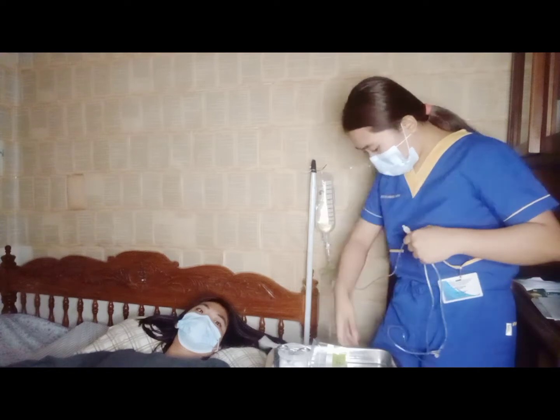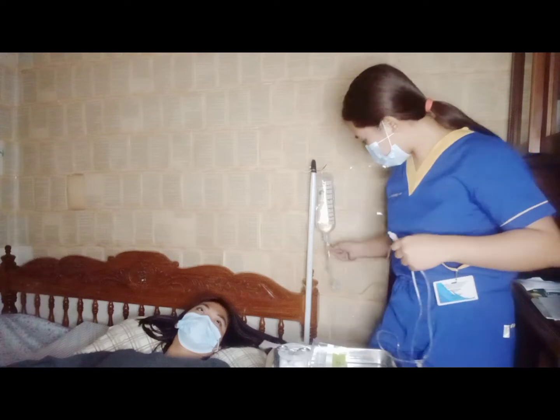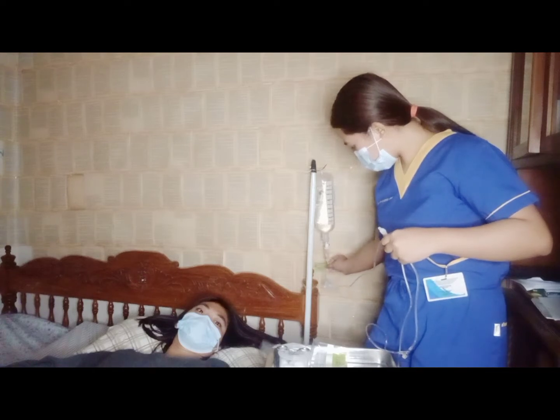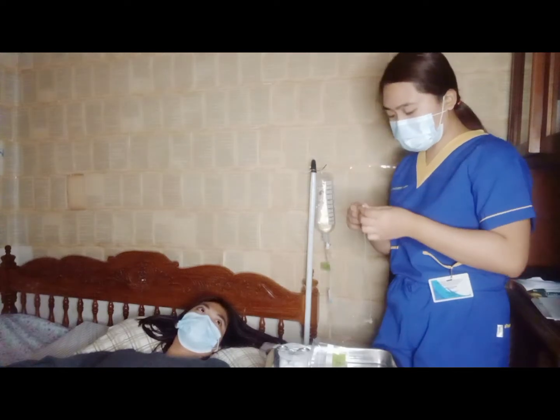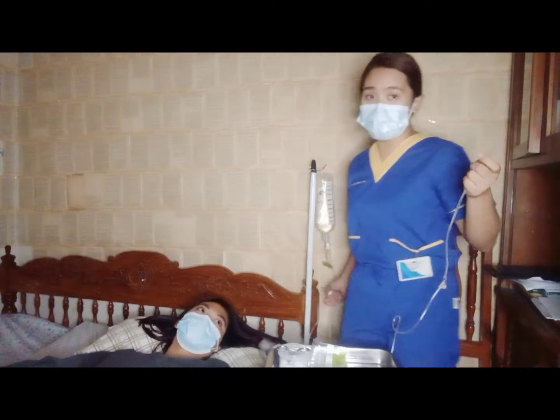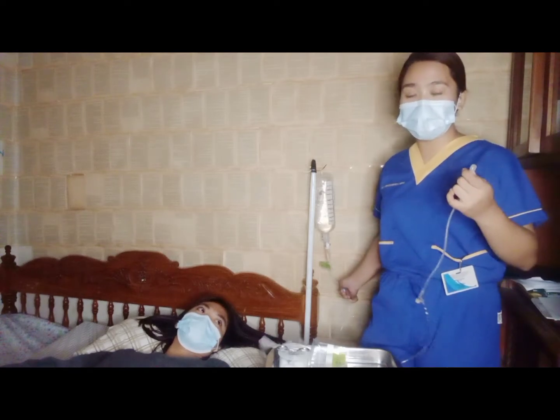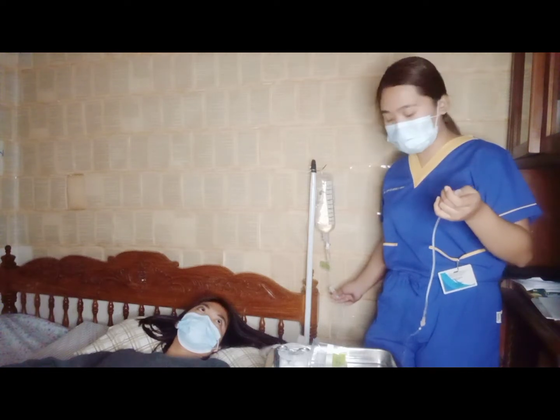Then after that, we'll open the cap at the end of the tubing to prime the tubing. We'll prime the tubing until the air bubbles disappear, which can cause venous air embolism, and wait until the tubing is filled with IV solution.